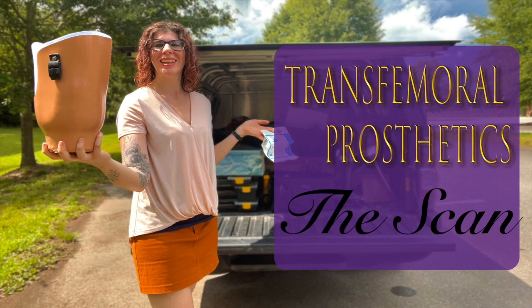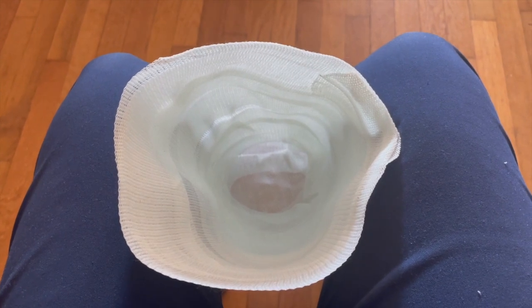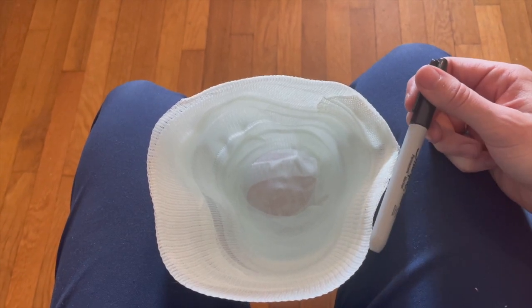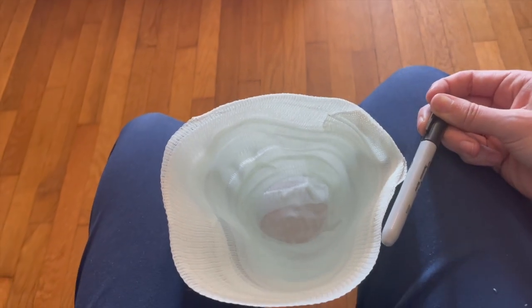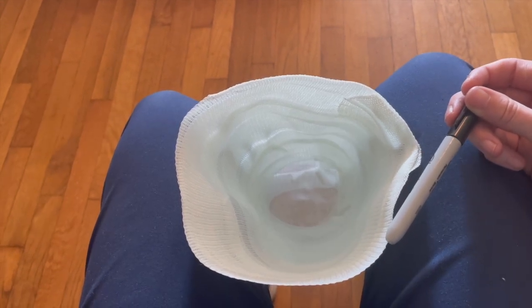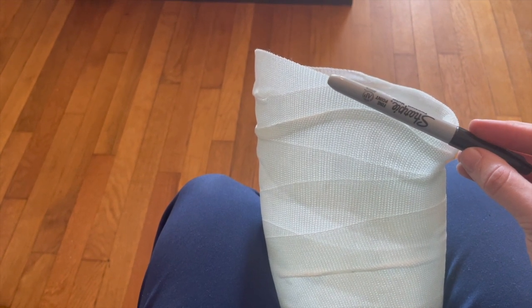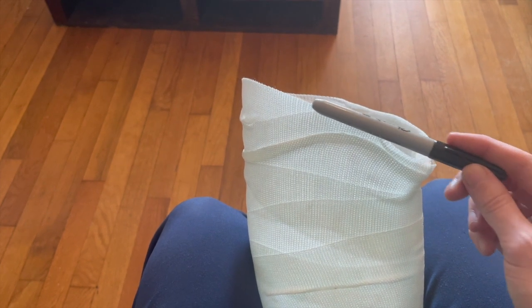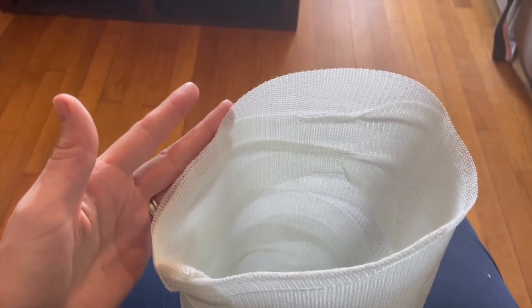When it comes to building in your containment, think of this pen as the ischium ramus of the pelvis — where I put that piece during casting, her ischium ramus is going to be sitting right where this pen is. A few things to keep in mind: how open is that angle — it's going to be more open for females than males. You're also noting how broad or narrow the containment needs to be, the exit angle, and how much medial containment you can get.